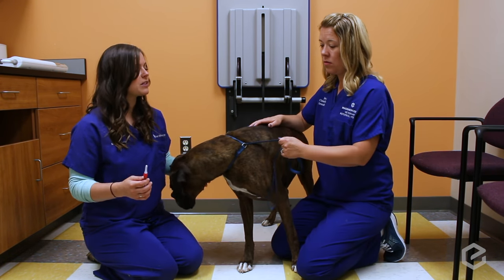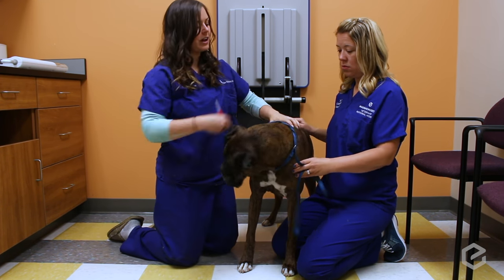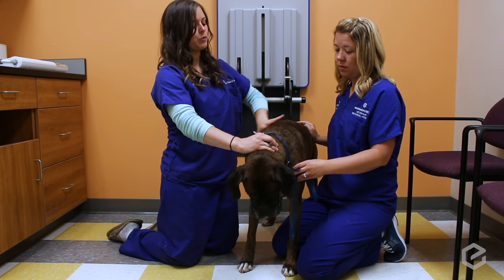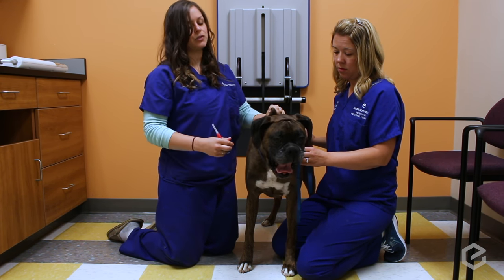The way we typically do it, and where we typically do it, is right in the back around the shoulder area, where there's lots of loose skin and lots of space for you to do it.